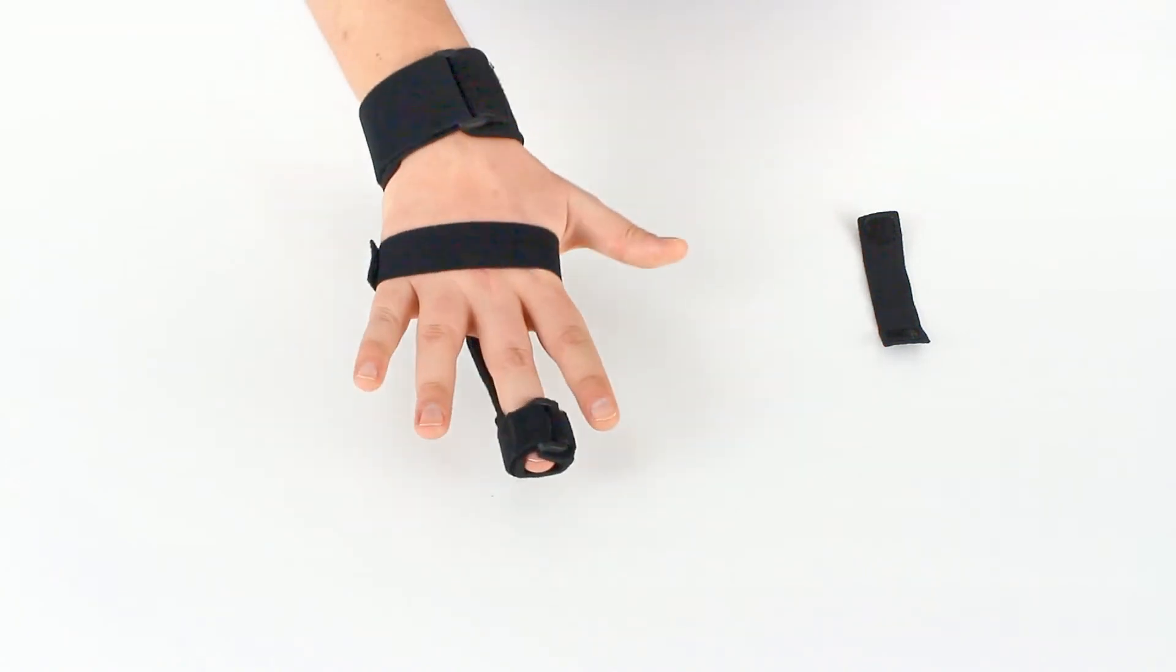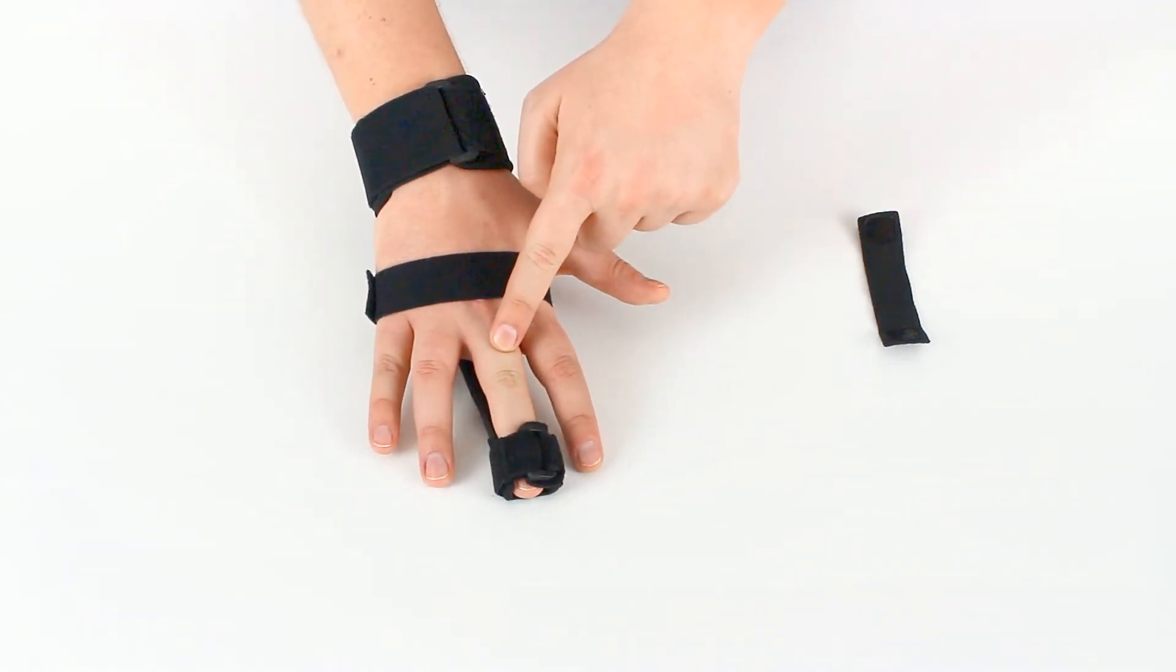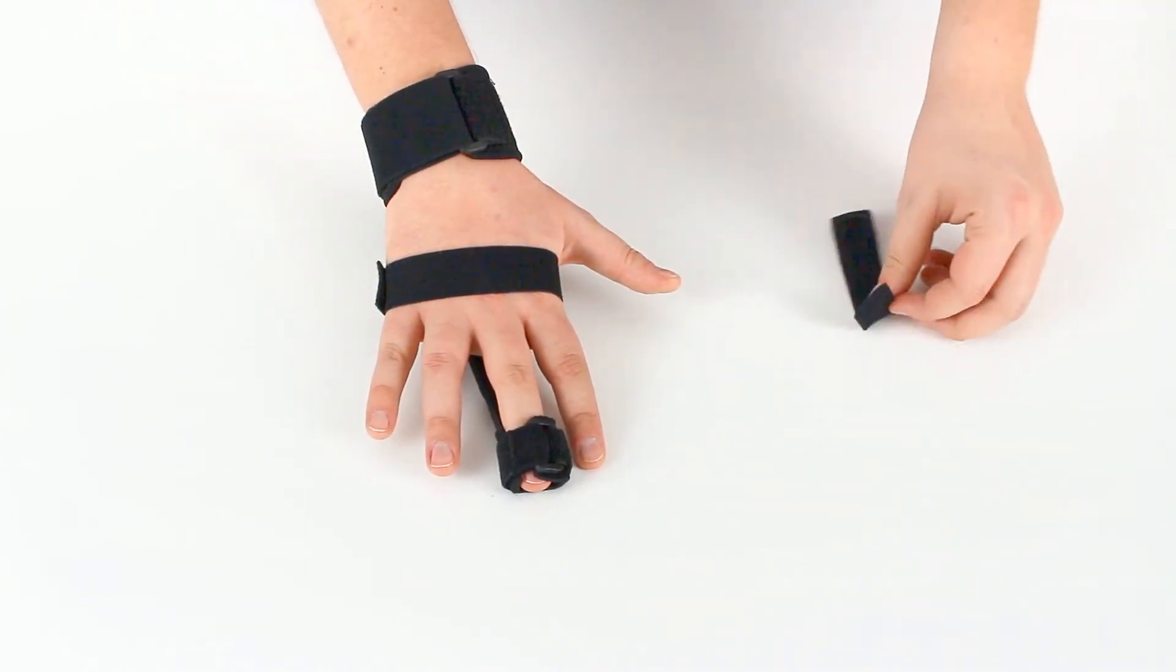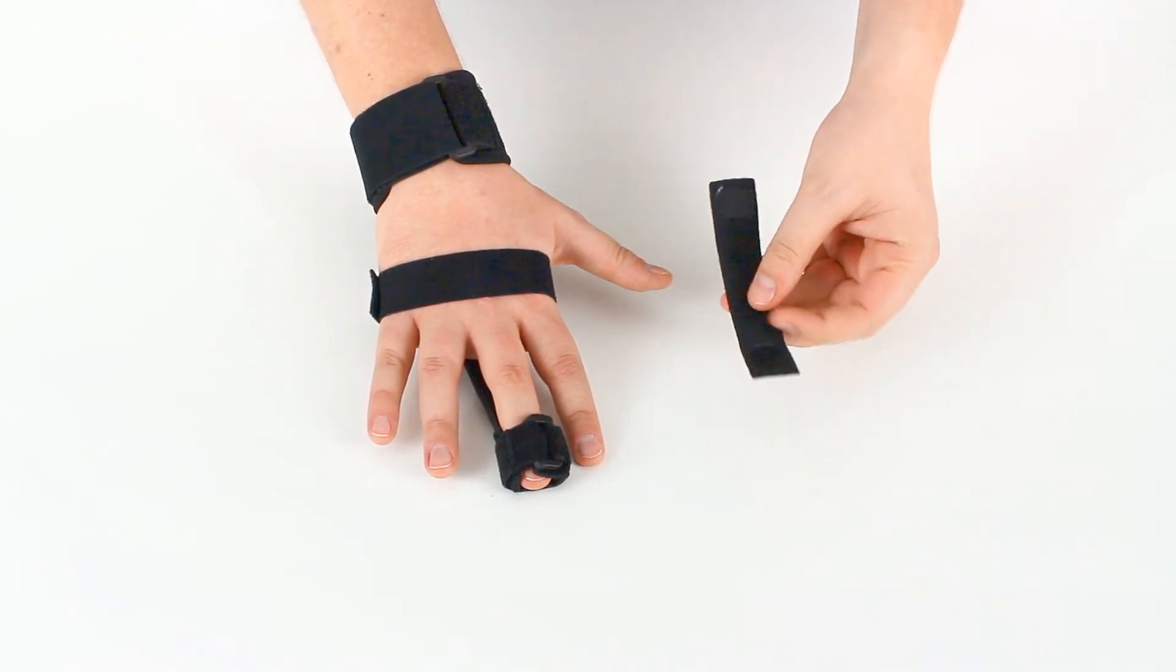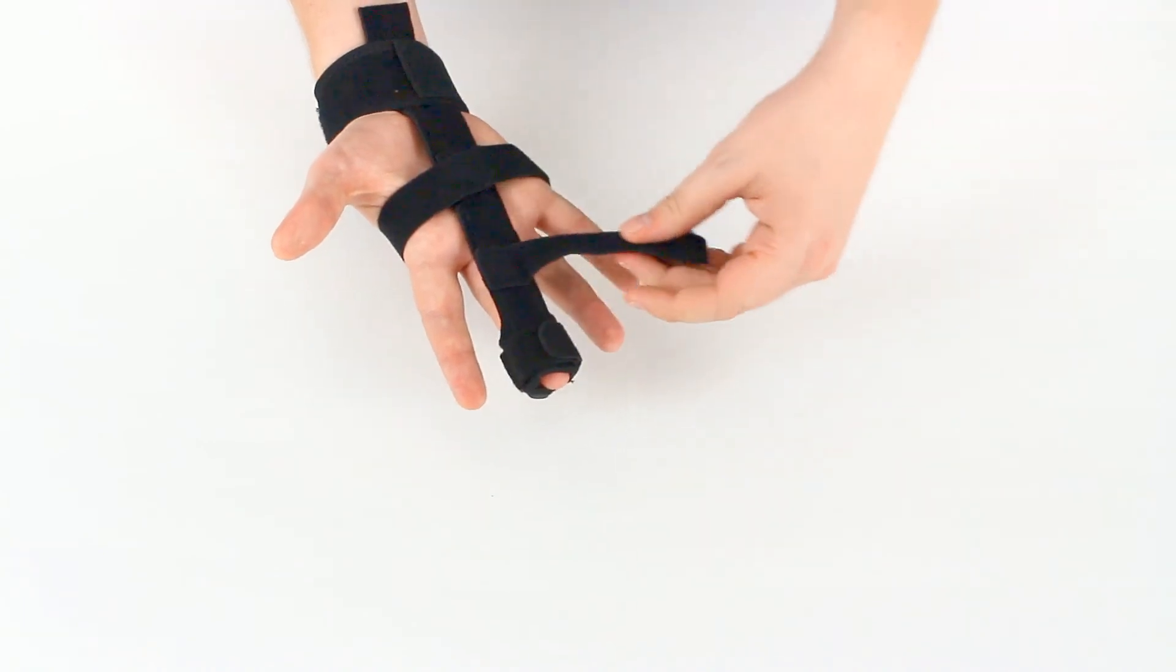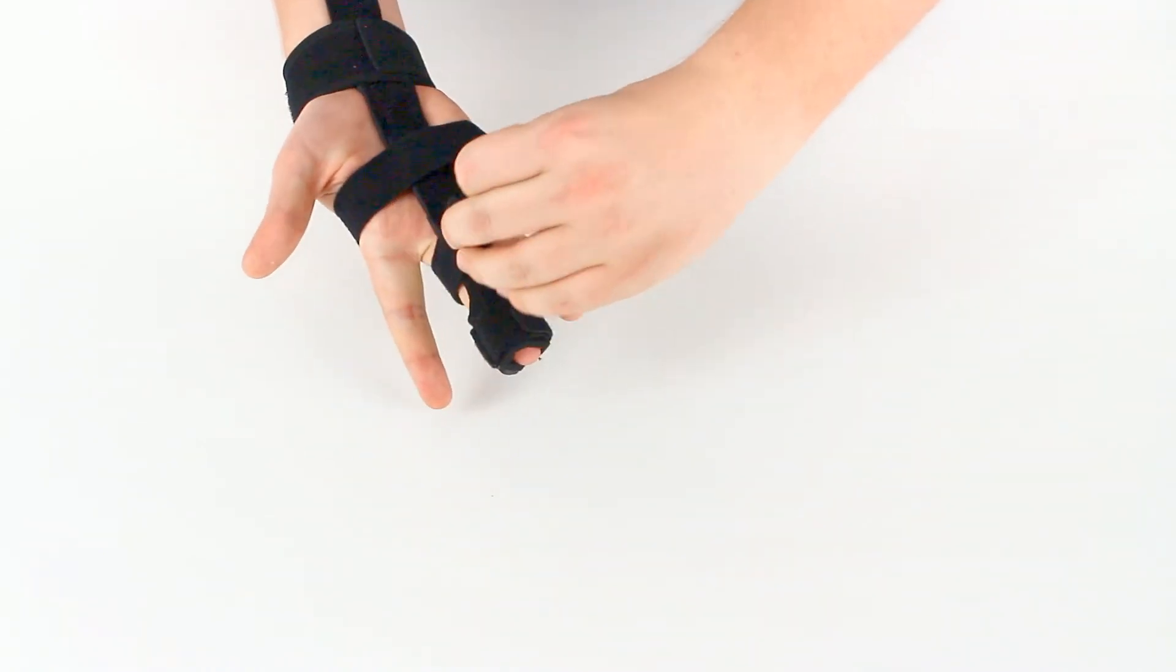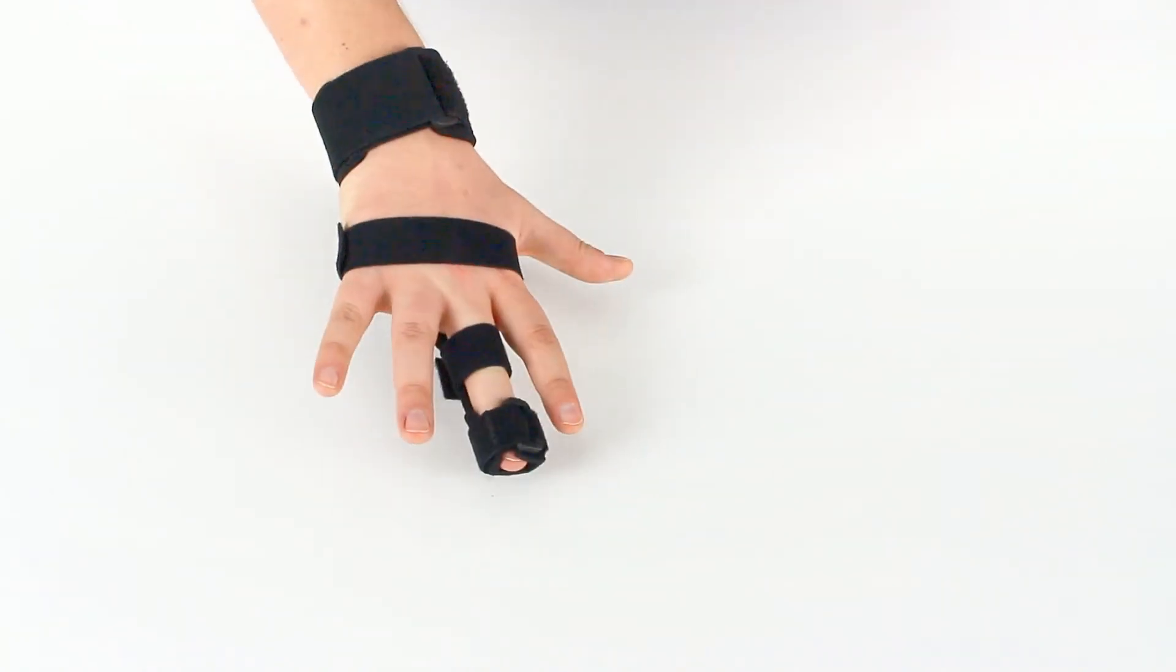Now if we need a little more stability on the finger here just to prevent that knuckle from moving or the finger from rising up, we can use the additional finger strap. Now there's only velcro on one side. So you'll just place it there, bring that around, and attach it to itself, and you're all set.